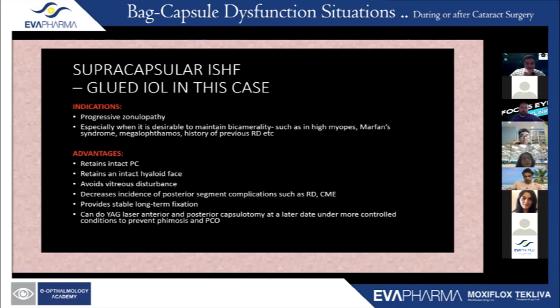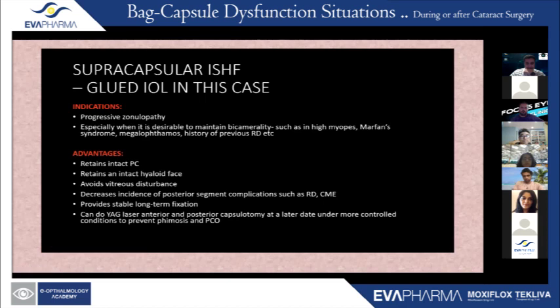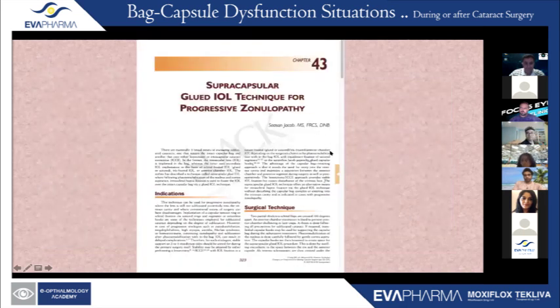There are a couple of ways that you can address this problem. Yes, you can get a phimosis of the bag, and what you can do in this situation, or maybe I can talk about that during the discussion, and go back to my presentation for now. We published this, as I said, in JCRS, and also in numerous book chapters. The latest work was David Chang's book, where I wrote a chapter on this technique.